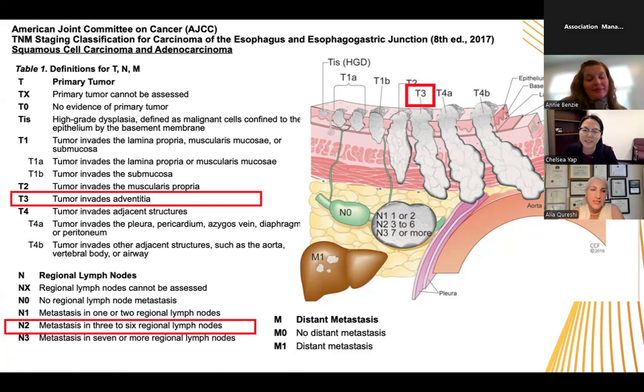So gastric preconditioning is a form of planning ahead and increasing the blood supply for your conduit. I will often do this for 2 classes of patients, at least that's what the data shows. Patients who will benefit are smokers, and I believe this gentleman was a smoker, and also diabetics. It's quite simple when you do your diagnostic lap and washings, as I often will for a GE junction cancer.